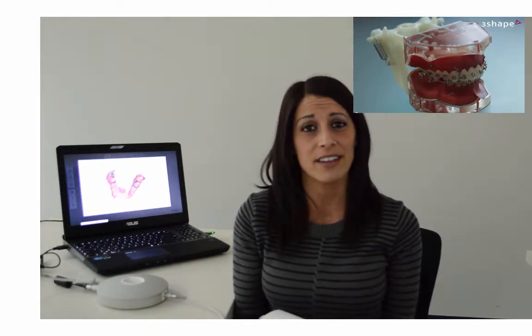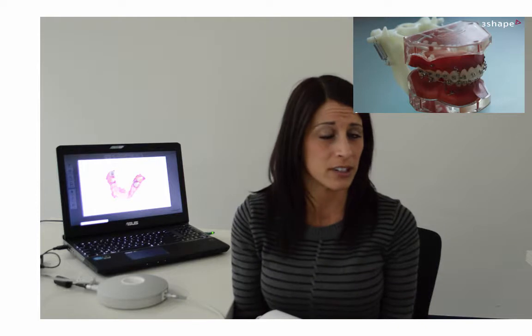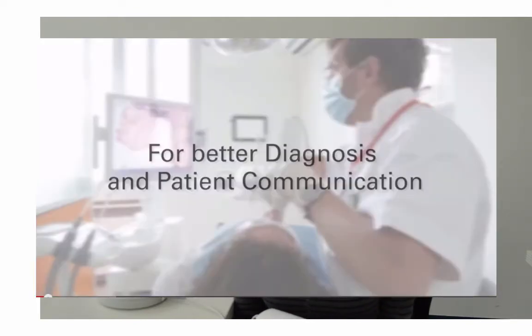The beauty of ThreeShape Trios is it has lots of modules available to you, one of them being our ortho analyzer. Everything is done in real time, which allows the lab to deliver appliances faster to you, which allows you to deliver them faster to your patients, which in turn allows you to make more money. Patients will also trust and understand the treatment plan you are communicating to them because it's in real time, and you will receive higher treatment acceptance because your patient is able to visually see their diagnosis right there in front of them.